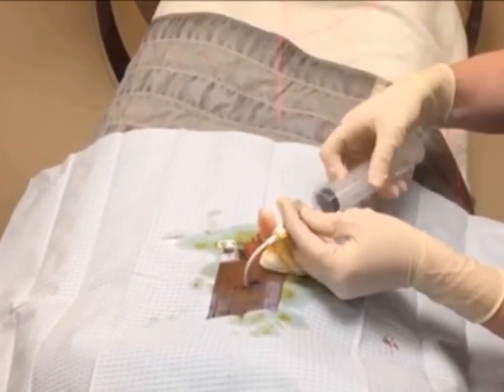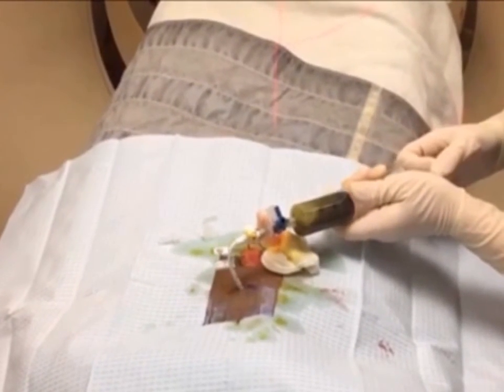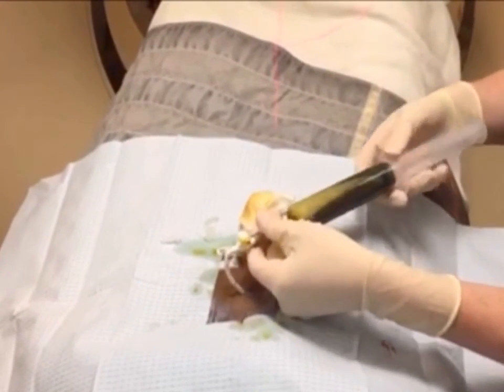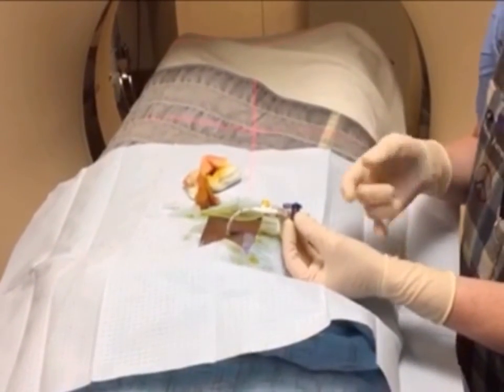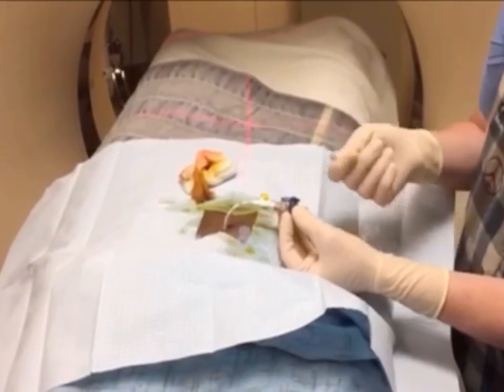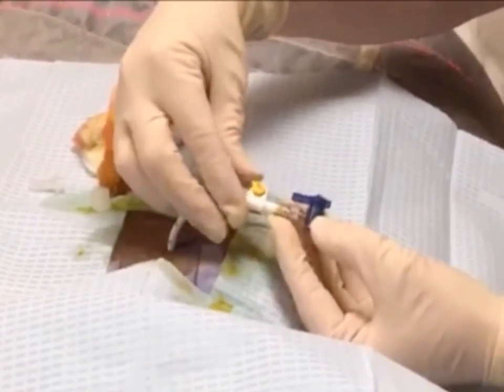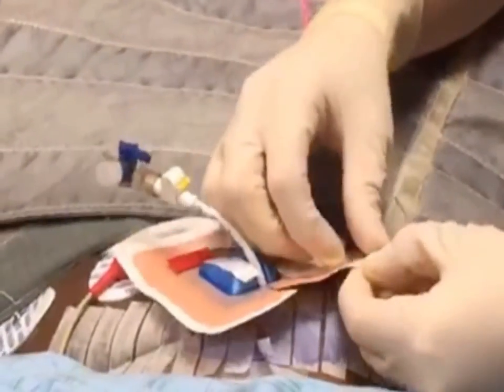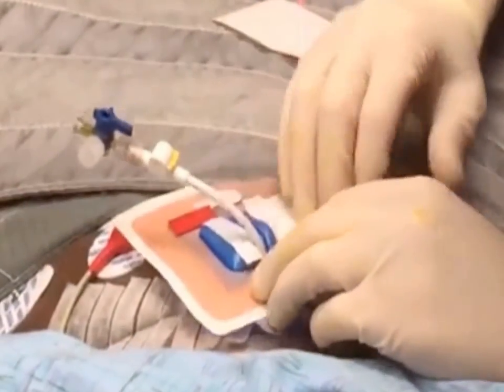Once the catheter is in position, a syringe can be attached and a fluid sample is withdrawn to be sent to the lab for analysis. Most drainage catheters used in this procedure have an intrinsic locking device to maintain position. In this case, a pigtail in the catheter was locked by tightening a string which coiled and fixed the catheter tip within the cavity. Once the pigtail has been locked, the string is removed. Additional security can be obtained by externally fixing the catheter to the skin using an adhesive device such as a stay-fix dressing.